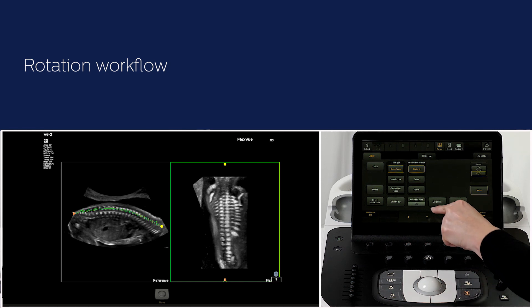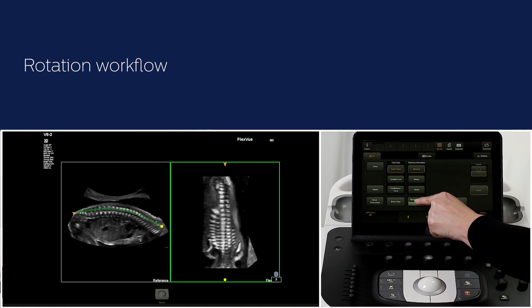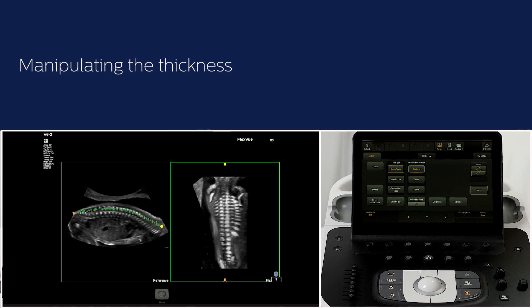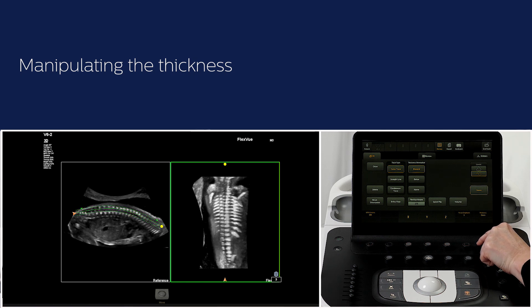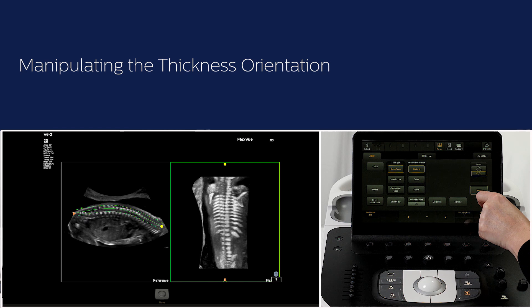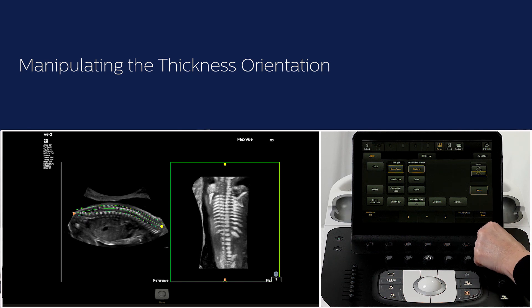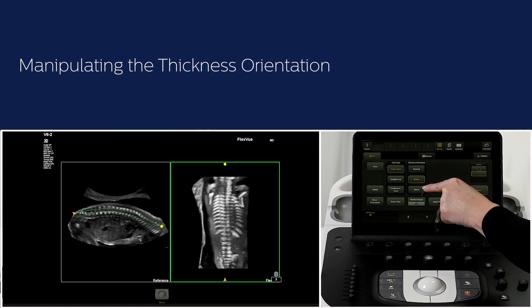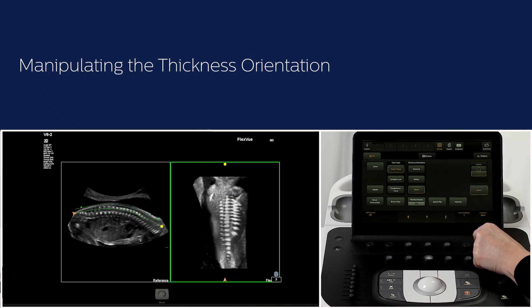You can rotate the FlexView image by pressing rotate on the touchscreen. You can manipulate the FlexView trace by changing the thickness — turn this rotary knob and see the change in the solid line. If you choose bilateral in the thickness orientation, the dotted lines on both sides of the solid line will move away or closer. Choose below in the thickness orientation menu and you will notice the dotted line only below the solid line. Choose above and you will notice the dotted line above the solid trace line.